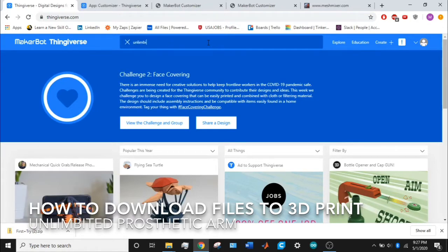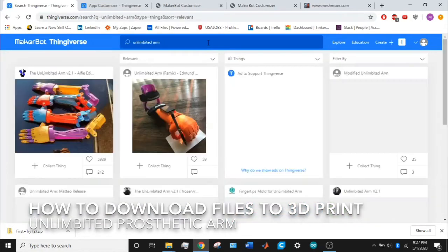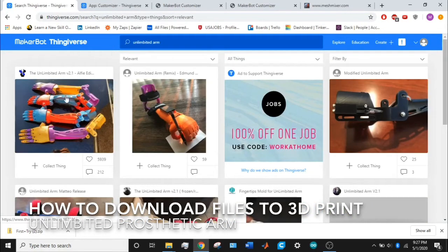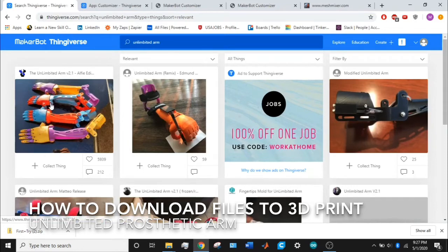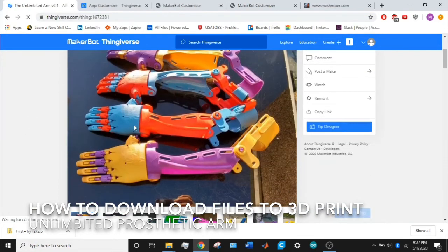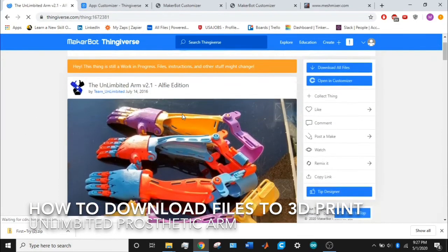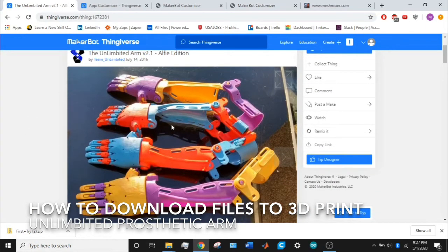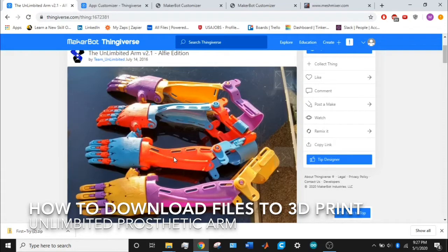Once you get on there, choose the top left one, the UnLimbited version 2.1 arm, right where my cursor is. Once you click on that, you can see their home page. This prosthetic arm is mainly for people who have amputations below the elbow, so they have at least part of their forearm left but no wrist.